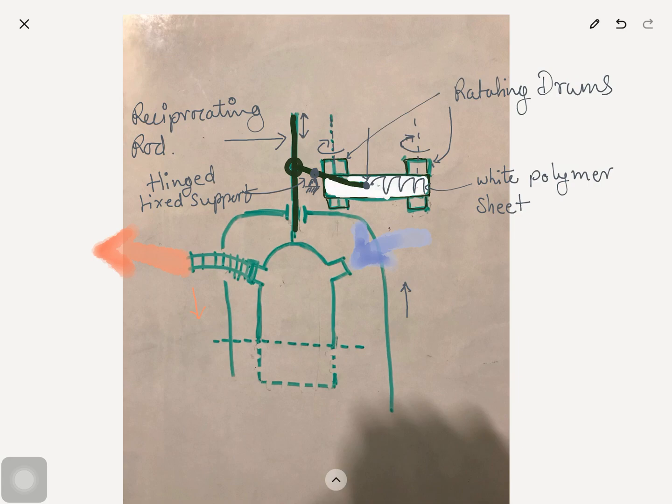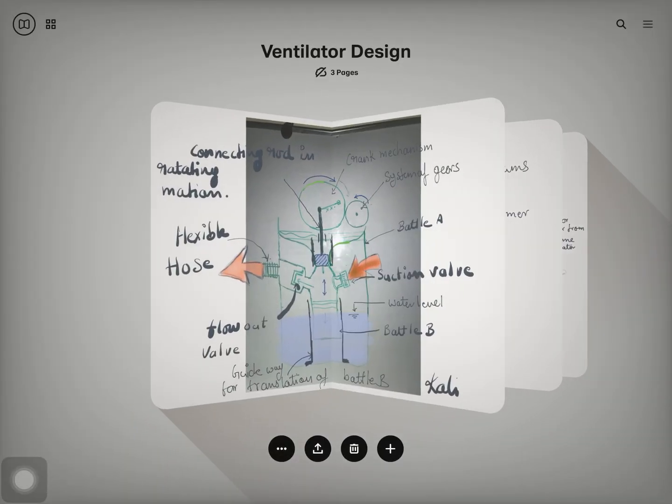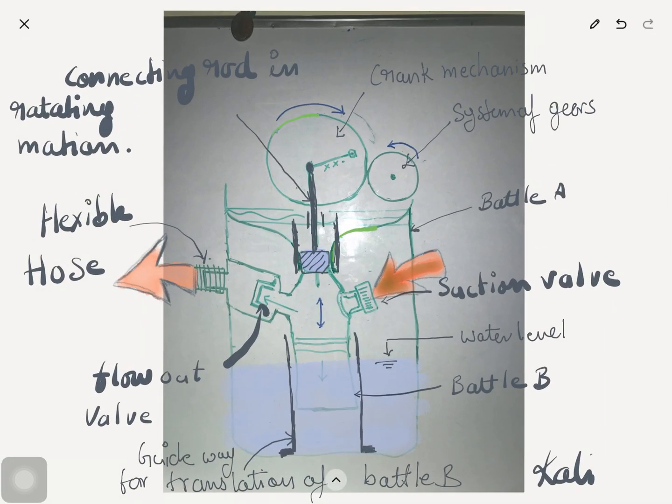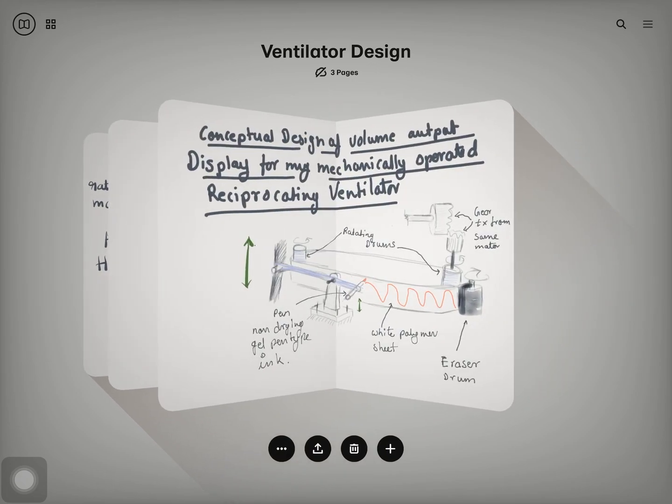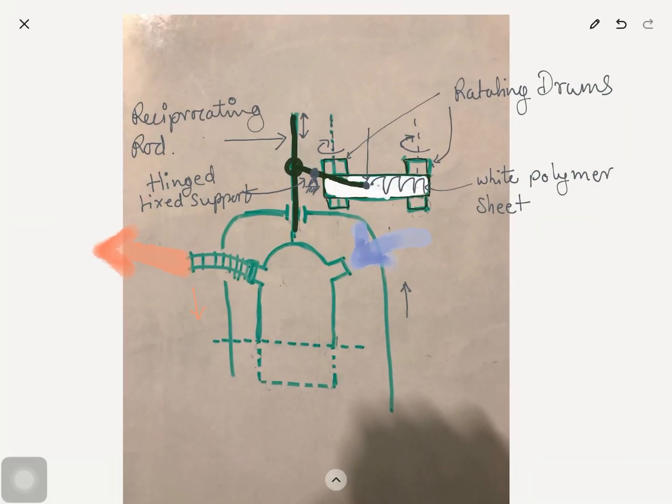As you have seen in my previous diagram, there's a lot of clutter in this. If you have understood my last video explaining the design, I come down to a simplistic view of the design. This is basically with the prerequisite that you understand my design, and we will go further only then.